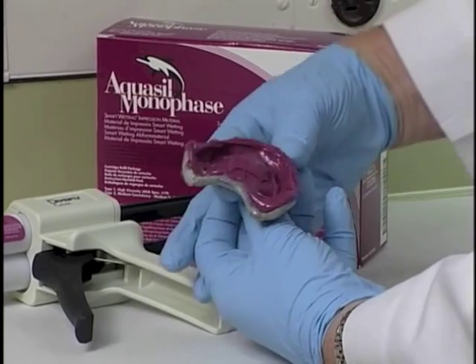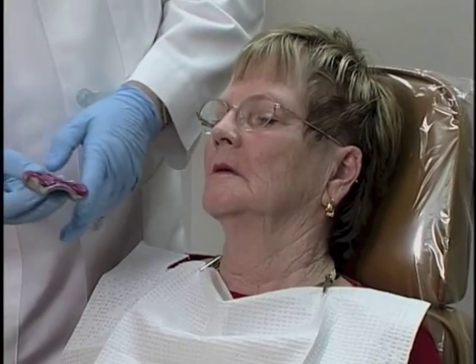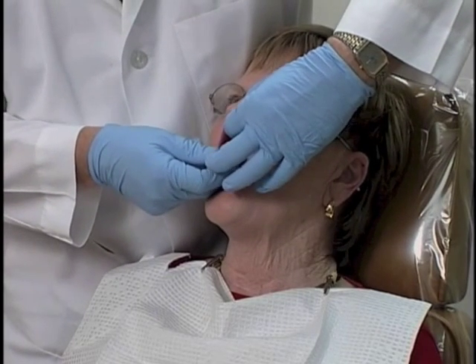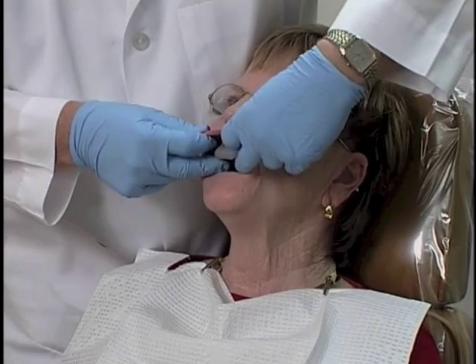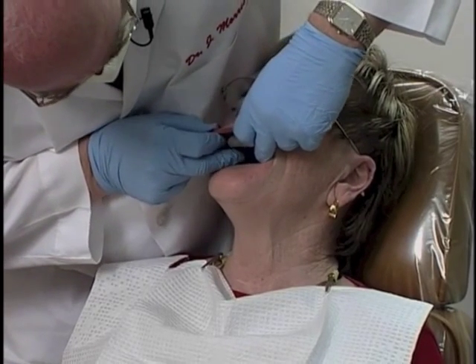Now we're ready to go to the patient's mouth. Now we insert the tray into the patient's mouth by rotating it into the mouth, and when we get it in position centered, I like to turn loose with my forefingers and seat the tray with my middle fingers, using the forefingers and the thumb to pull the lip and cheeks all the way out of the way as we seat the impression.